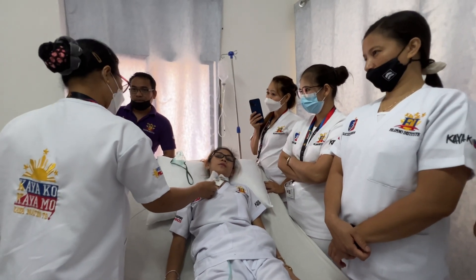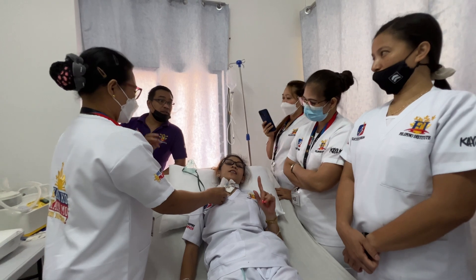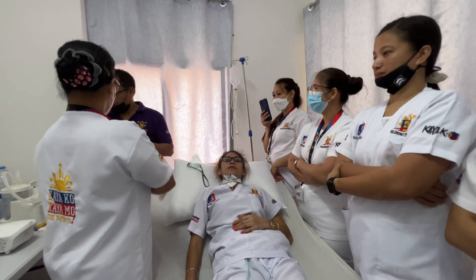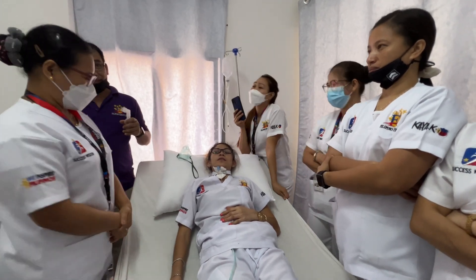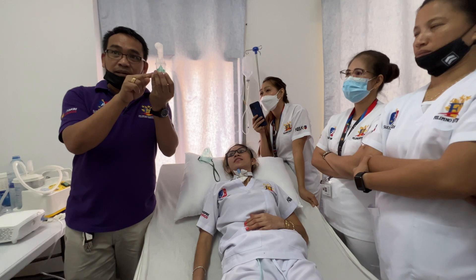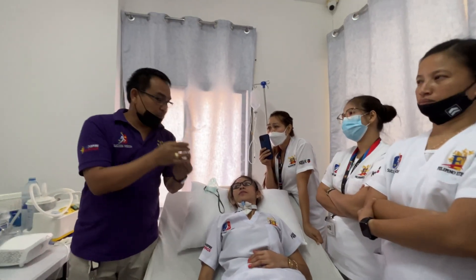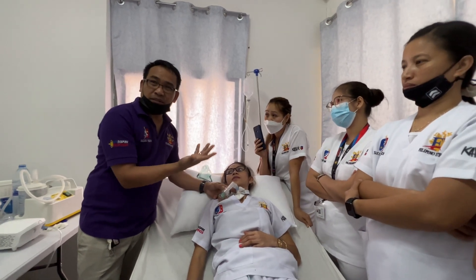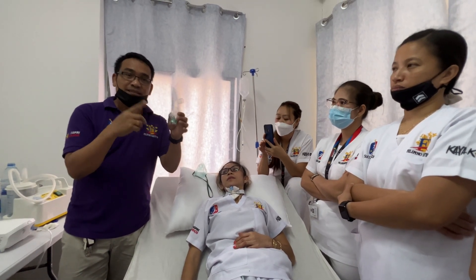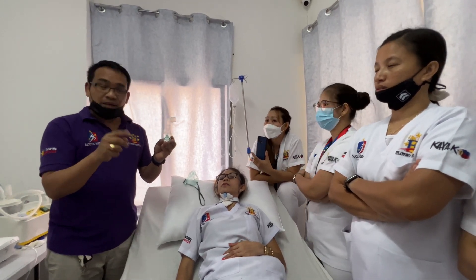Are you going to finish all the medication? No. Why? If you see it's already cloudy in there, because your medication is clear when you put it in. After five minutes, if you see a cloudy solution or residue, stop — because that means the medication is already absorbed. No need to finish all of it. Turn the oxygen back on.